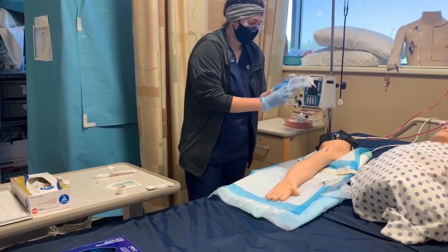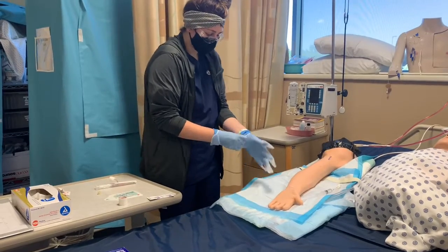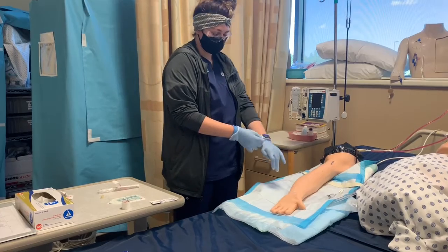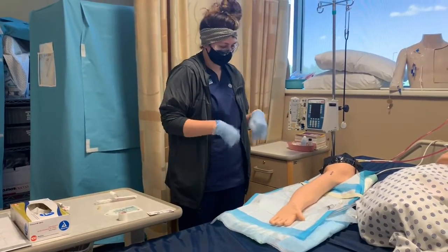have her apply some heat, or I could have her clench her fist in and out to help them pop. Lifespan considerations: if this was somebody elderly or a young child, I would use a different gauge needle or IV cannula, and I would probably have somebody come in with me to help stabilize their arm and help keep them calm.